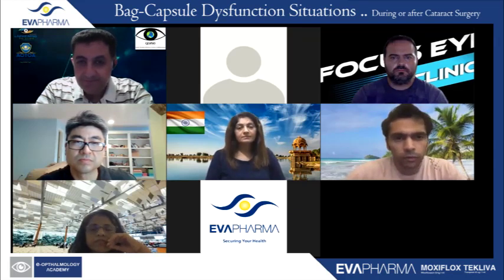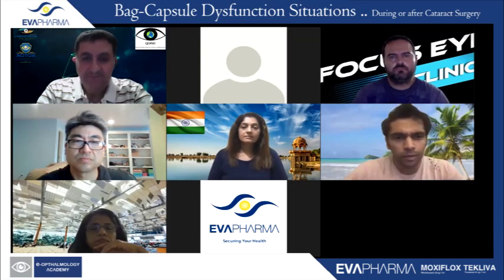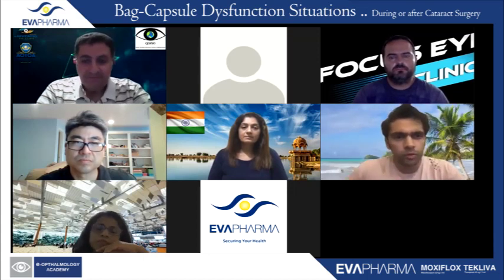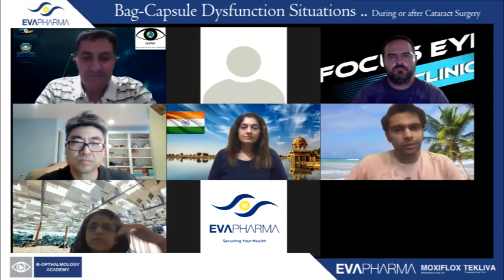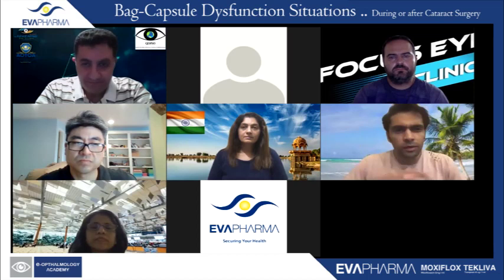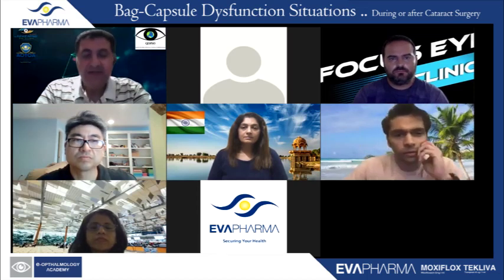Because I know all of us over here like retaining the bag as much as we can. But, and we'll talk about the situations later, what do you do in those situations where the bag is progressively zonulopathic: pseudoexfoliation, Marfan's, and so forth? Your comments on that?